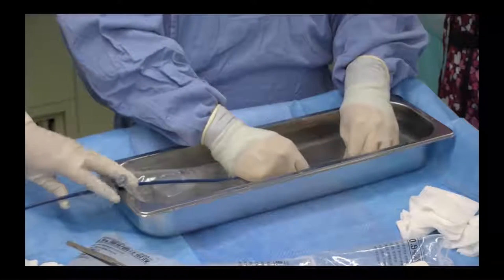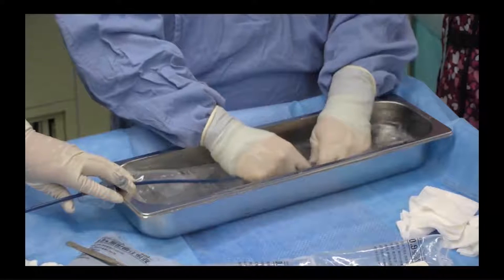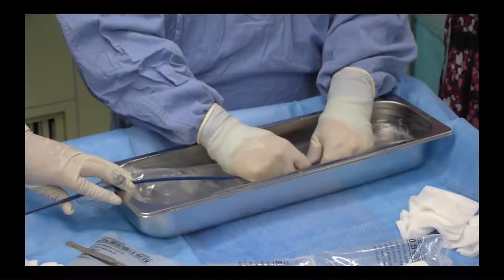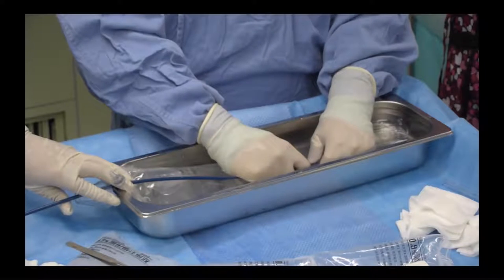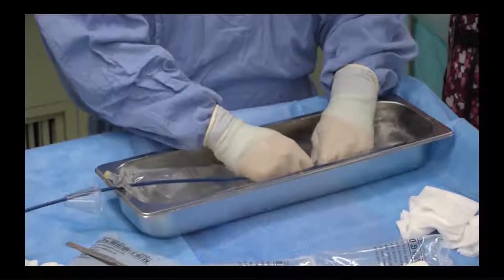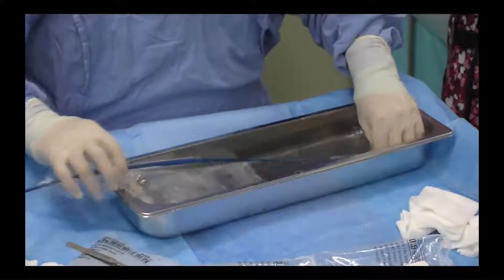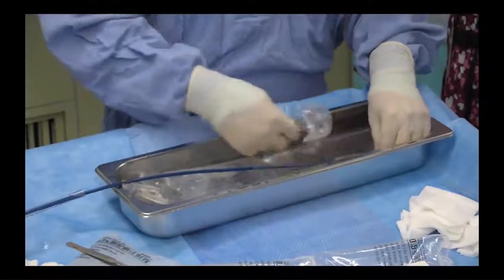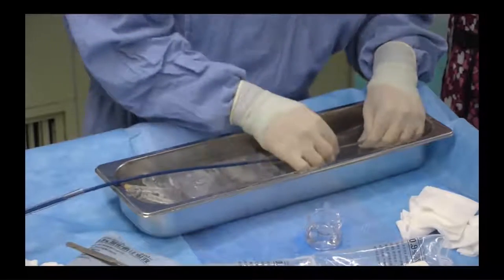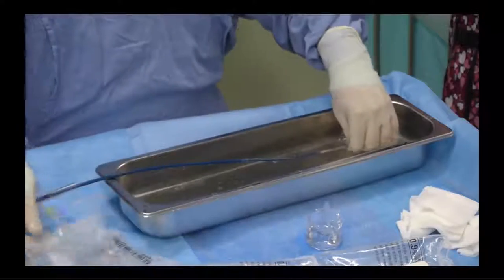So is there a default to go manual if the motor breaks? Well, with the Centera, we've not really had the motor break because it's a detachable handle. So you can just pick up a new handle with the Centera and put it on. With this device, it looks as though the handle is not detachable. So if there were a problem with the motor or the battery, you would need a manual backup. The Centera doesn't have a manual backup. Just change the handle. So I assume that's maybe the issue.